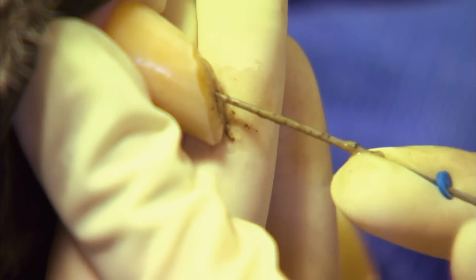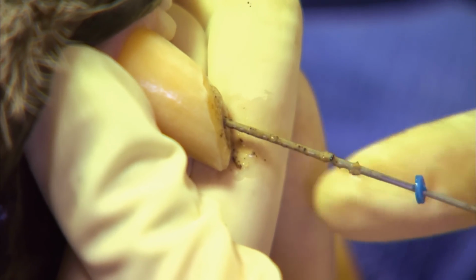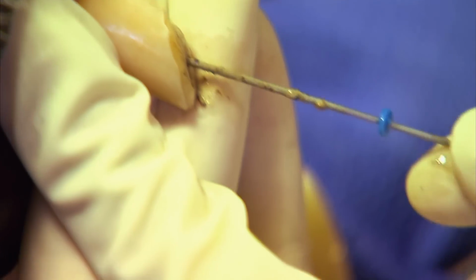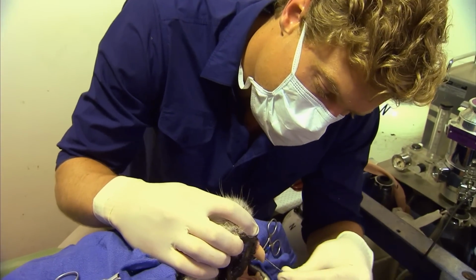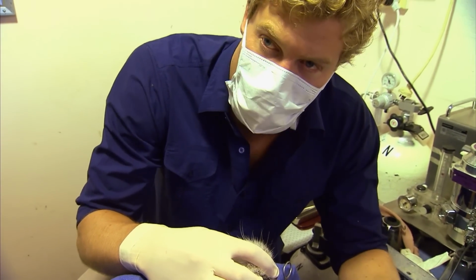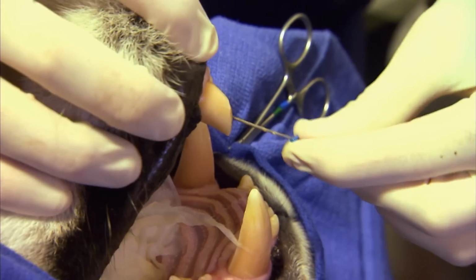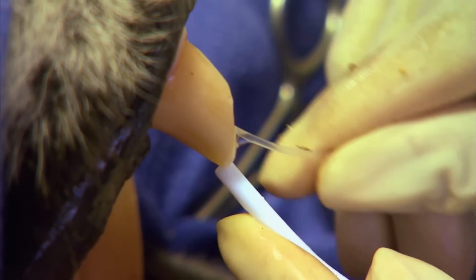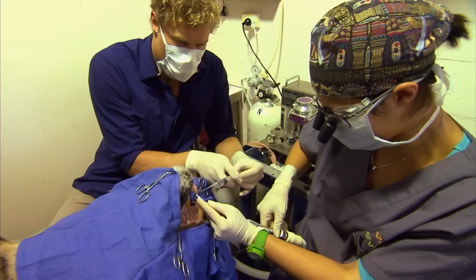What we'll be doing is going inside the tooth itself with some files and basically scraping the inside out, getting all that nasty muck, the infection, all out of there. All this black material you're seeing coming out is the infected part, so you can see that really the damage you see on the surface is nothing compared to what's actually brewing underneath, and what's brewing is quite a serious infection. That's it. Much less black muck coming out now, so we're winning.